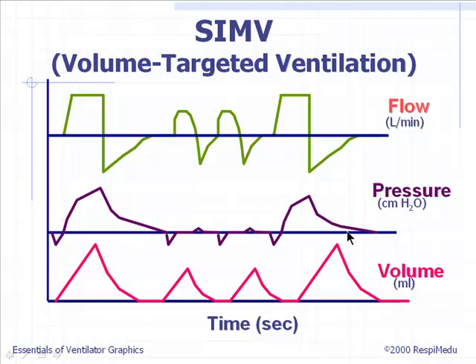As you can see, the intermittent SIMV breaths are of a standardized set tidal volume, whereas the patient's spontaneous breaths in this particular example happen to be smaller. The reason these breaths are smaller is simply a manifestation that the set tidal volume is larger than that which the patient either needs or is capable of generating given their relative strength and the mechanics of the respiratory system.